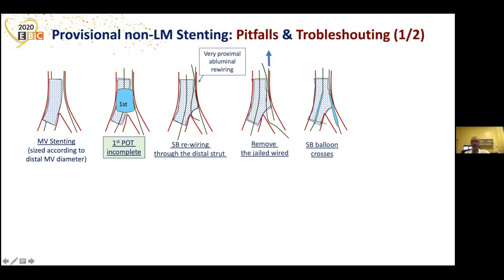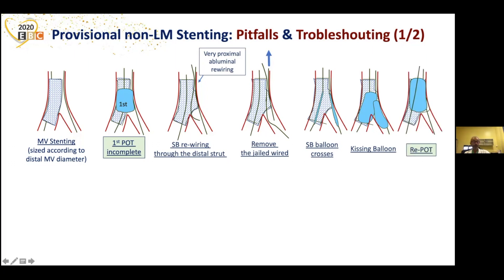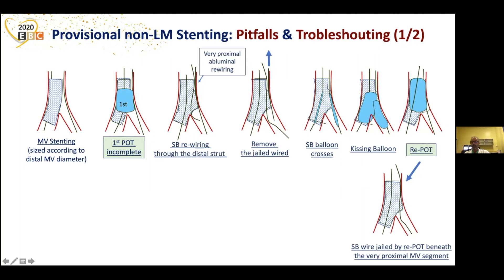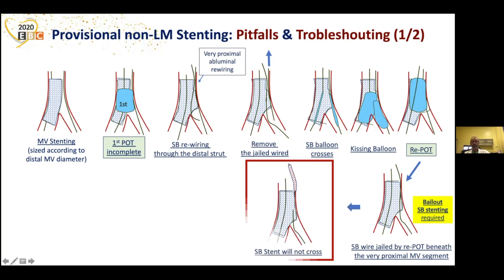You perform your kissing balloon very close to the bifurcation, then deflate and remove the balloons. Then you do your repot, as suggested and recommended by the guidelines. But when you do the repot, the side branch wire is jailed by the repot beneath the very proximal main vessel segment. A bailout side branch stenting is then required, but the stent in the side branch will not cross, because the wire was jailed by the repot.